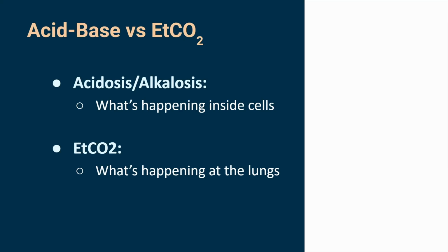I think these lines get crossed because we talk about them in the same day or two, but alkalosis and end tidal do have some associations, but, well, how do I want to phrase that? I think at this point, we can have a conversation about acid base and about how it makes oxygenation harder, but that's kind of a niche and isolated conversation. Now we just want to talk about the end tidal and all the respiratory effects that can result from that.